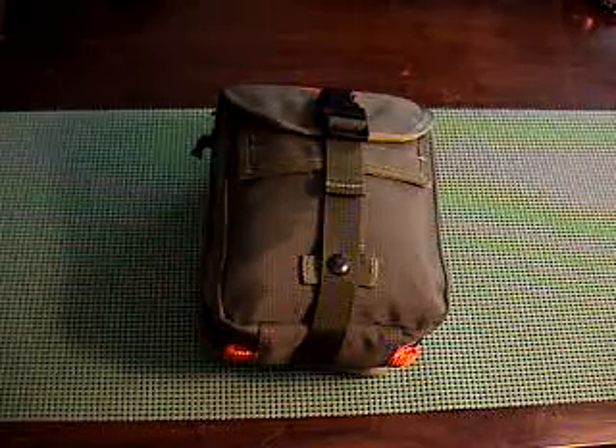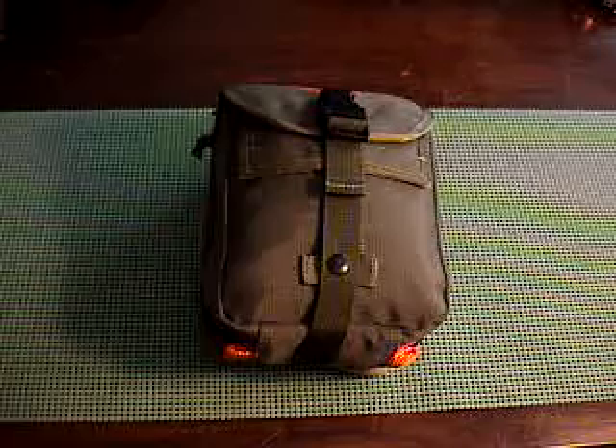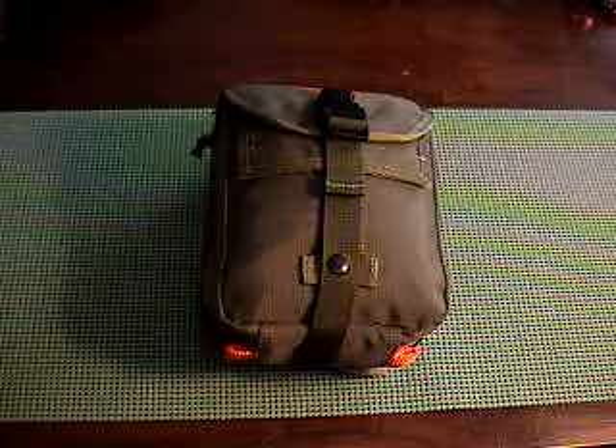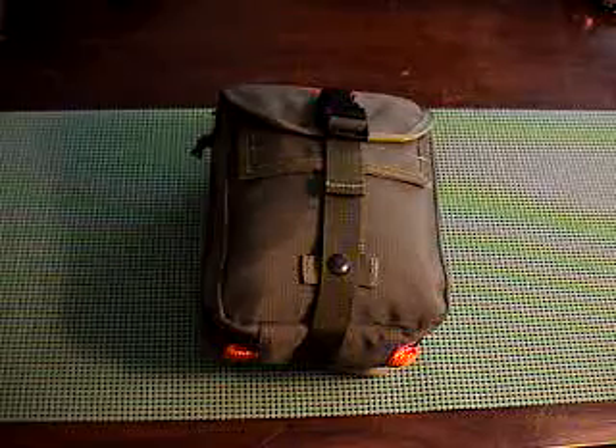Hey guys, Brent here. I am doing a video on the Maxpedition FIGHT Medical Pouch. I'm just going to go through what's in it. I got this pouch from eBay — it was like $45.